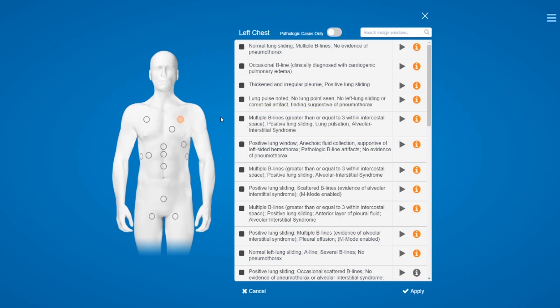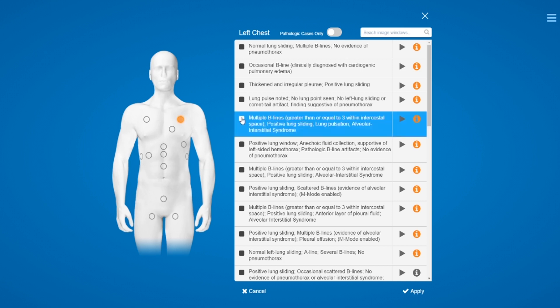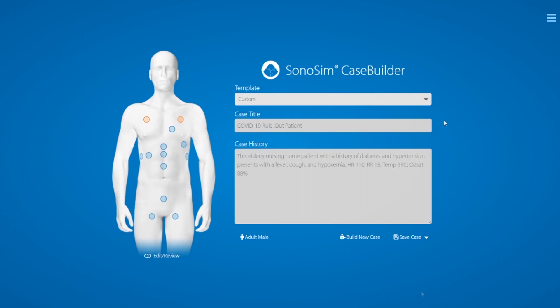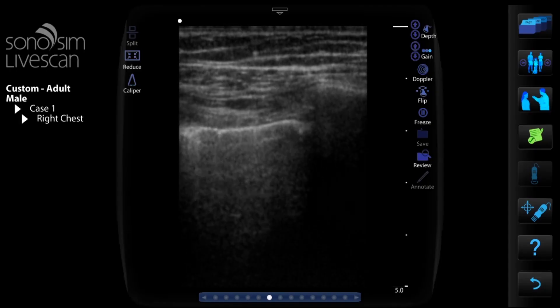With Case Builder, you can pick from different imaging windows with pathology and create over one million unique training cases. Simply choose what kind of pathology you want your training case to have. For instance, if you want to simulate the sonographic assessment of a COVID rule-out patient, you can select Lung Windows and look to identify relevant pathologic findings, such as B-lines or focal or diffuse consolidations. Once you have added all the windows for your remote simulation case, you can add a case title, a case history, and then access it in SonaSim LiveScan.